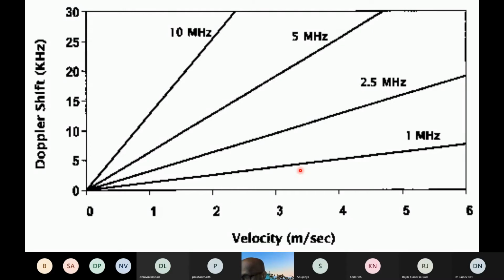This is in contrast with two-dimensional echocardiography, where the resolution is the best when the echo beam is perpendicular to the tissue or the blood which we are interrogating. Usually, when we are talking about two-dimensional echocardiography, we are dealing with morphology or anatomical features, whereas when you're dealing with Doppler effect, we are dealing with physiology. So this is the basic difference between 2D echocardiography and Doppler echocardiography.